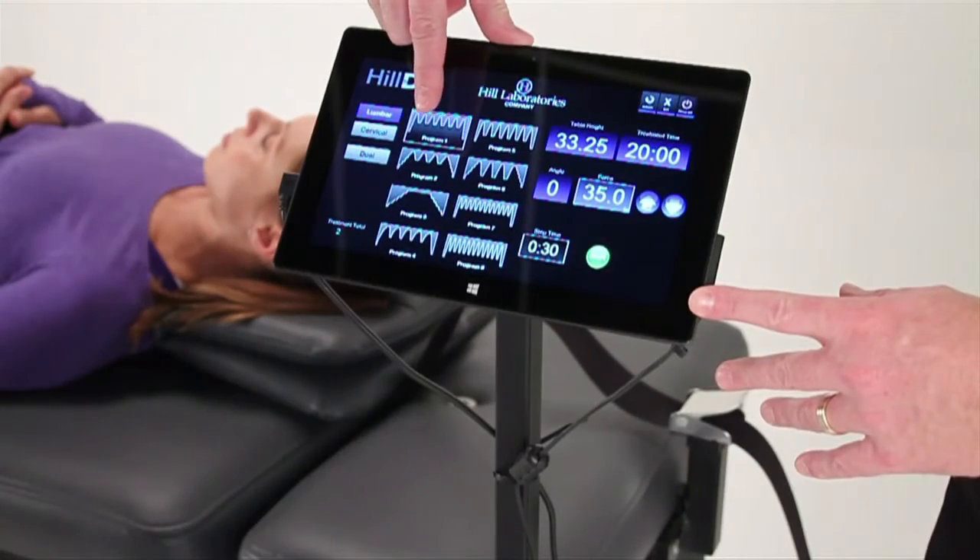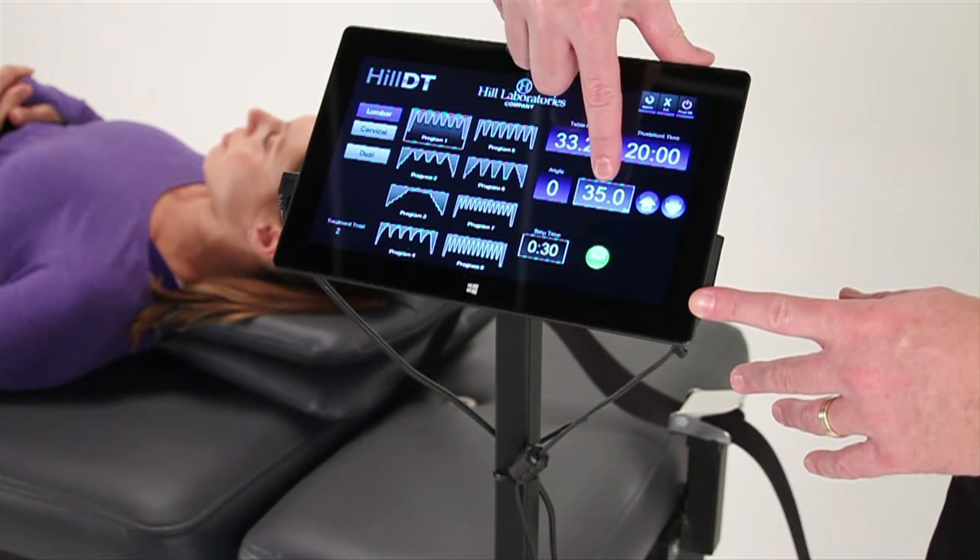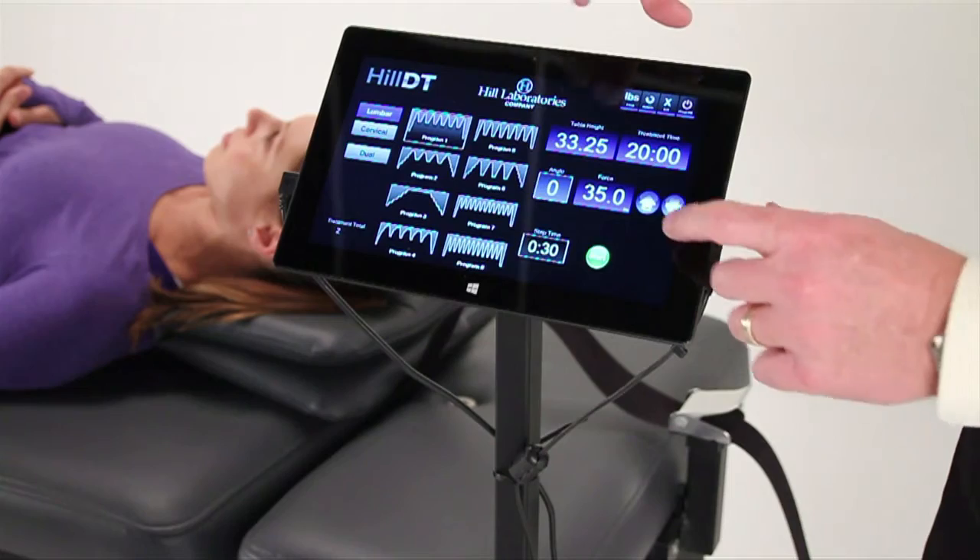Treatment selection on the Hill DT couldn't be easier, with eight touchscreen program presets and intuitive controls for entering and saving customized patient settings.